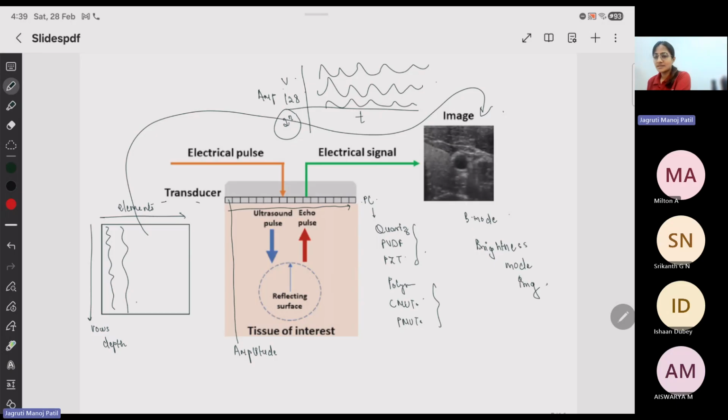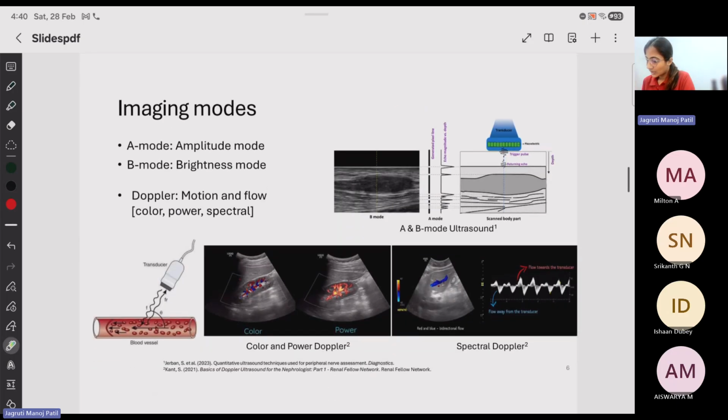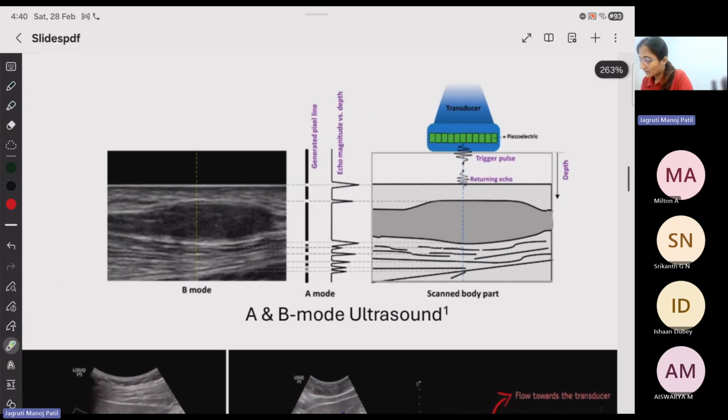The information that this type of image gives you, using these single lines, is only about 1D data. That's nothing but across rows. Now here, when you club all of them together, you get whole tissue-based level information. So here it was just local data, whereas here it gives you global information about your tissue or region of interest that you're trying to image. Okay, so that's how you club them all together, and here's a nice schematic of it.